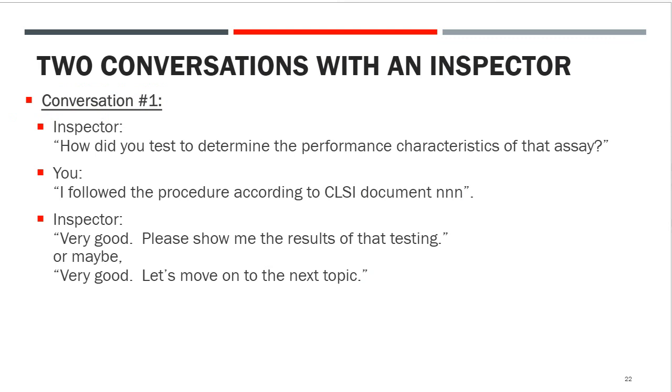When an inspector comes in to accredit your laboratory, you have a choice of 2 different types of conversations you can have. Conversation number 1, the inspector asks something like, how did you test to determine the performance characteristics of that assay? And you could answer, well, I followed the procedure according to CLSI document number, whatever the number is. The inspector will most likely say, very good, please show me the results of that testing, or maybe very good, let's move on to the next topic. All nice and clean, all taken care of.